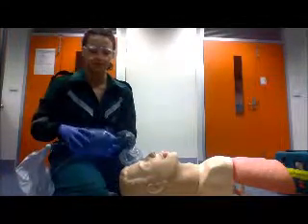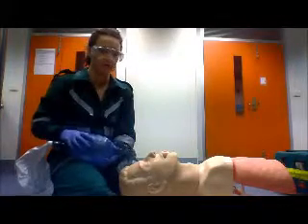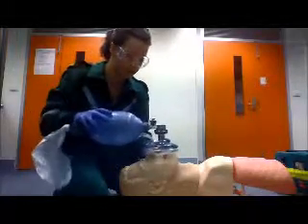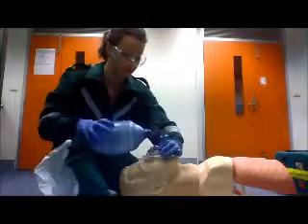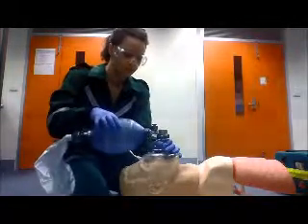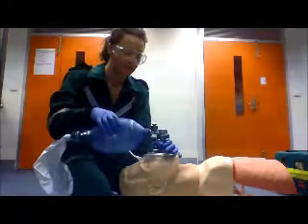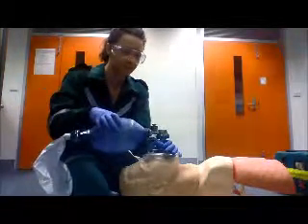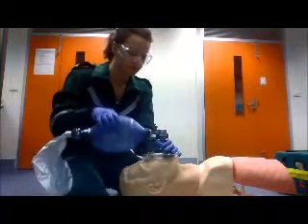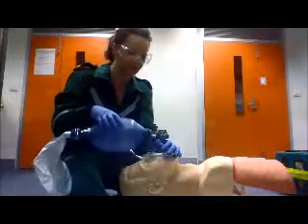Now for positive pressure ventilation. The patient should already be in the sniffing position with an OPA inserted. First you need to apply the mask over the patient's nose and mouth, ensuring you have a tight seal so that not too much air escapes. Then you need to ventilate the patient by squeezing the bag at a rate of 12 to 16 breaths per minute, with approximately 10 mL per kilogram of air. A common mistake when ventilating a patient is squeezing too hard and hyperventilating them, which could damage their alveoli.